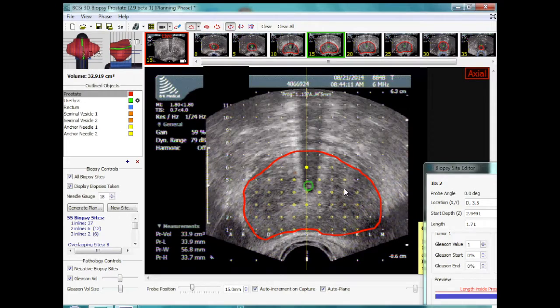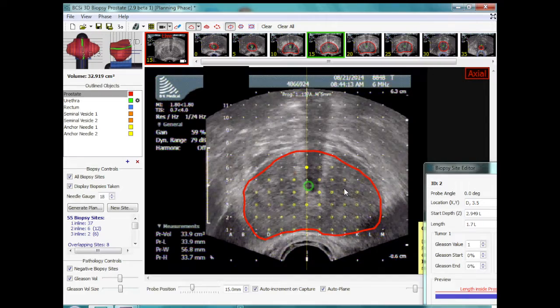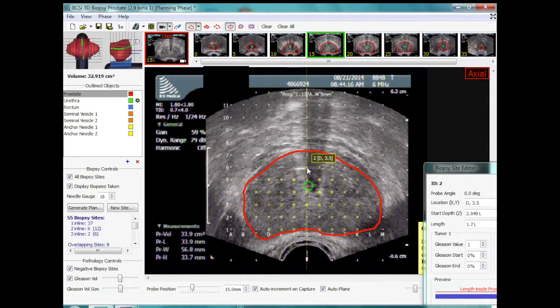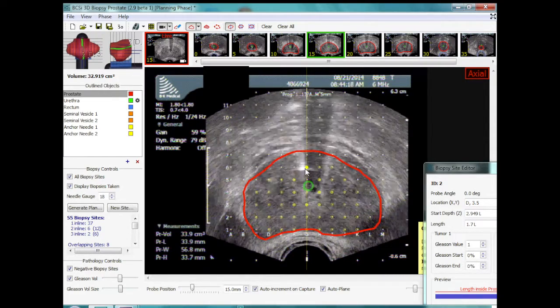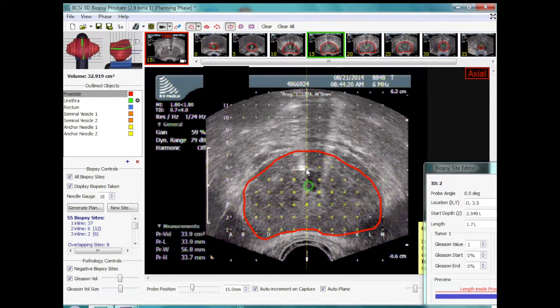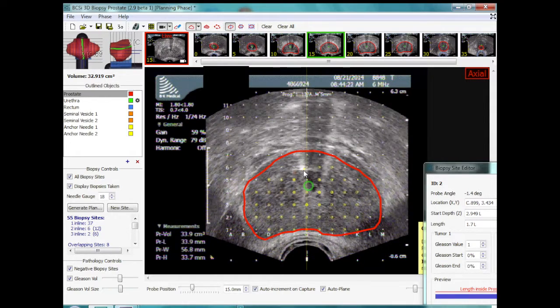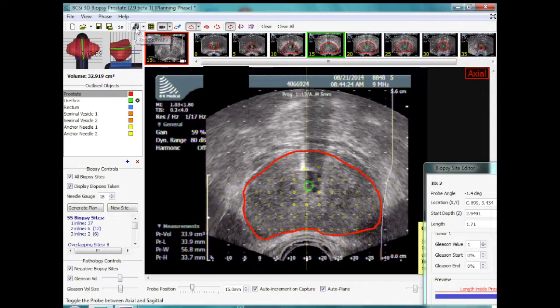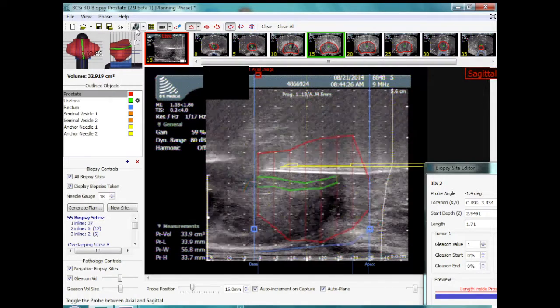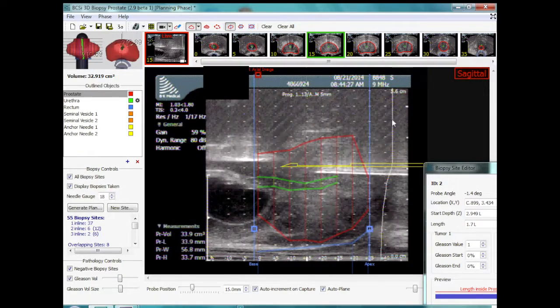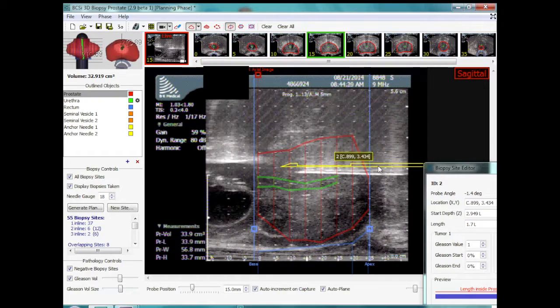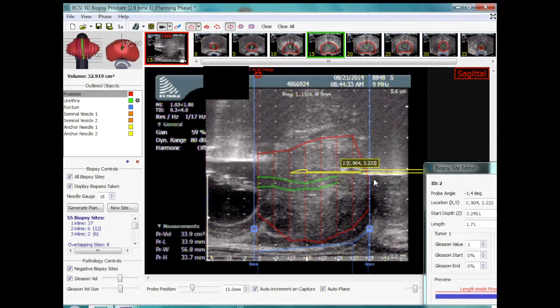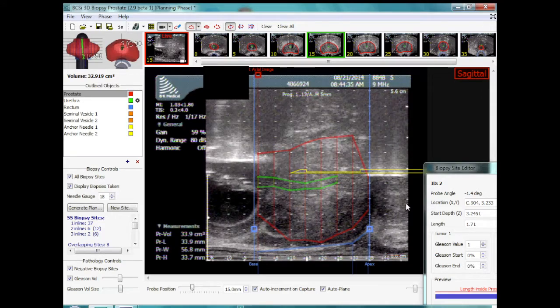The second biopsy is about to be taken and is seen on the axial image. The virtual needle needs to be moved so it overlies the actual needle. This step is important because the coordinates for the needle need to match in order to represent the actual biopsy site. Imaging is switched to sagittal and the virtual needle is lined up to the actual needle, which is pulled back to the apex and fired to take the sample.